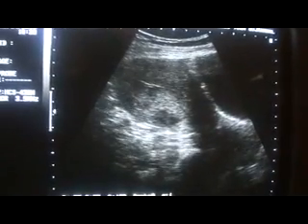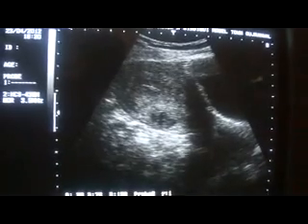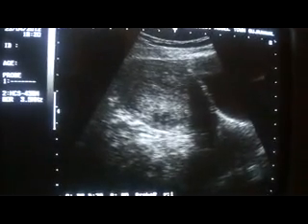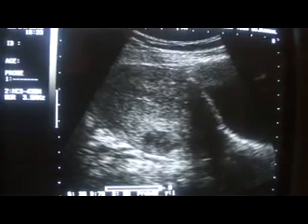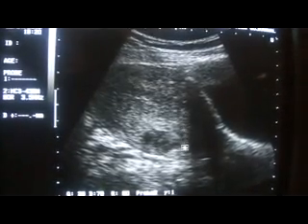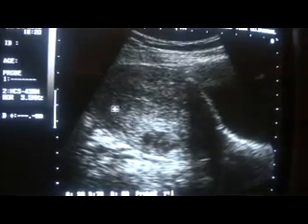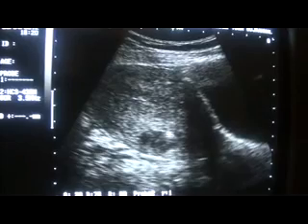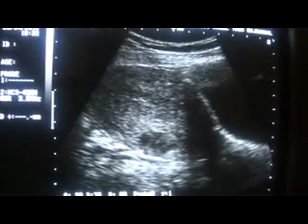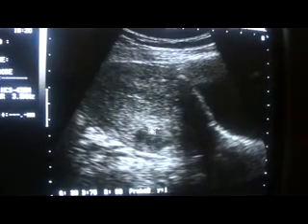Now, in the anterior wall, you will again see a focal lesion. This is a focal lesion in the lower part of the anterior wall of the uterus, which is echogenic in the center and surrounded by a hypoechoic rim, and is very well demarcated. Posterior wall is seen. Now, these are all solid because none of these give posterior wall acoustic enhancement if you concentrate.